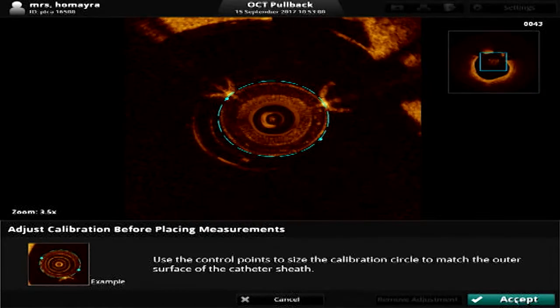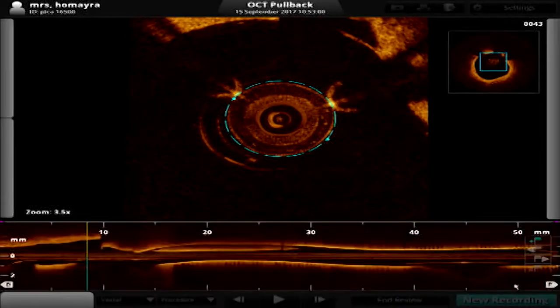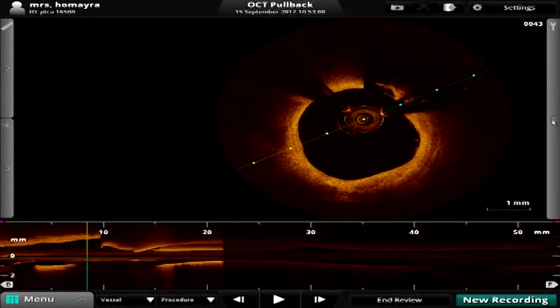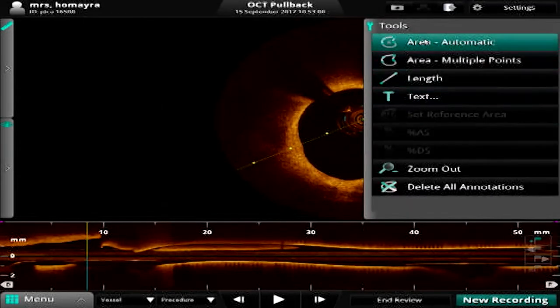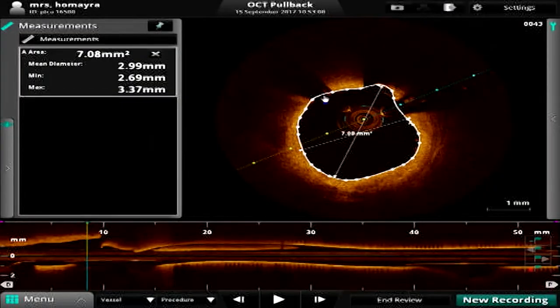So can we have a 3.5 into 18 BRS? 3.5 into 19, yes. So we have a 3.5, 19 BRS, and we'll overlap with the previous stent. 3.37 is the maximum, so the maximum diameter is coming at 3.37. So 3.5 should be okay.